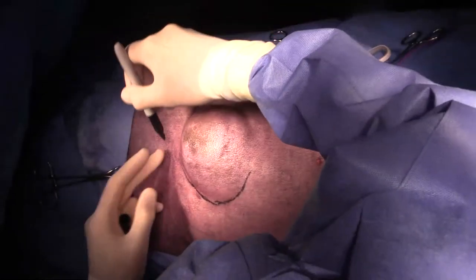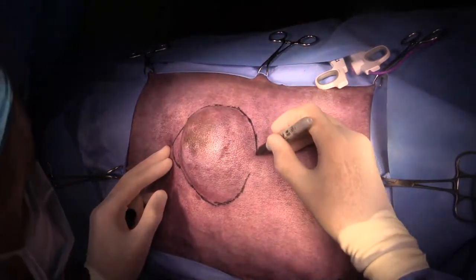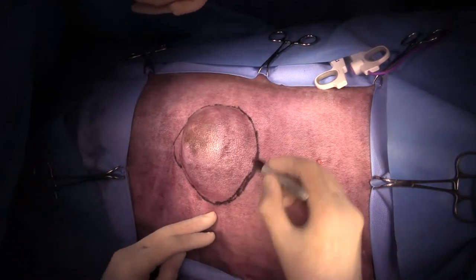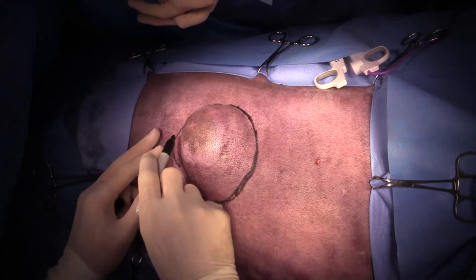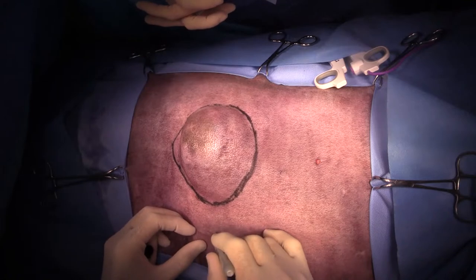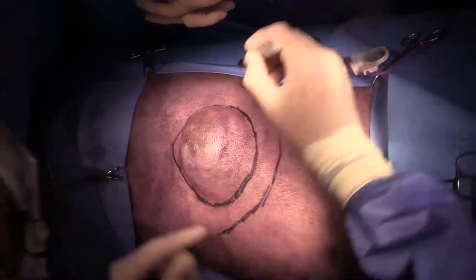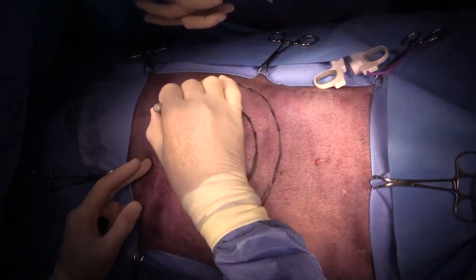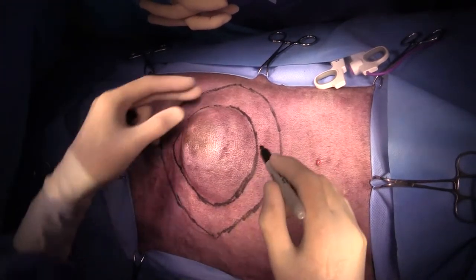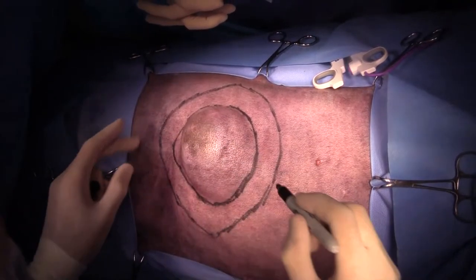Today we're removing a soft tissue sarcoma, a presumptive soft tissue sarcoma, off the chest wall of a dog. This is a Labrador Staffordshire Terrier cross that's developed this mass over the past several months that's grown progressively. It seems to be fluid filled and non-diagnostic on cytology, but it's multilobular, so there are some areas that are quite firm in the middle of it. So I'm fairly confident that we're dealing with a soft tissue sarcoma.